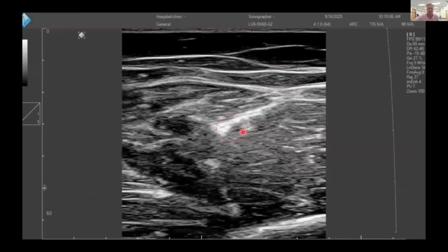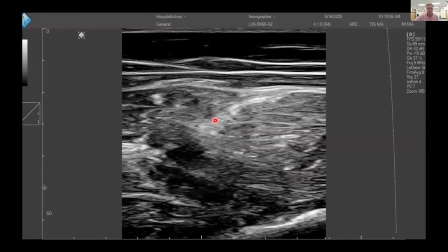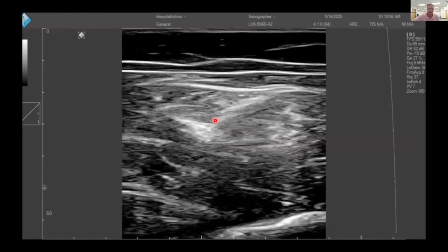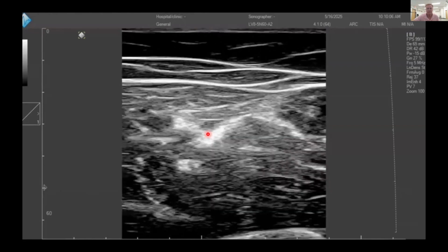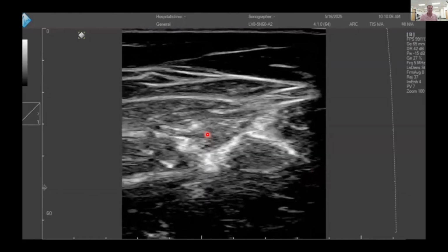But this is a recording that I took of my sciatic nerve. It might be a little bit glitchy on your screen. I'm hoping the videos play with a high enough frame rate, but this is the main nerve that obviously branches off to innervate your leg muscles. And you'll see that it doesn't really change shape too much as I sweep up and down my thigh.